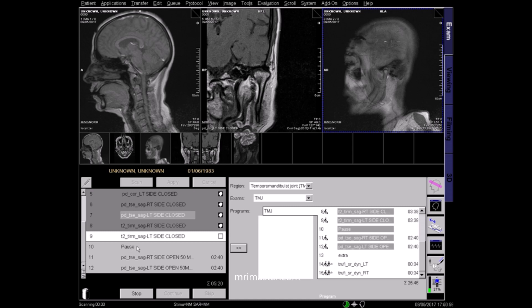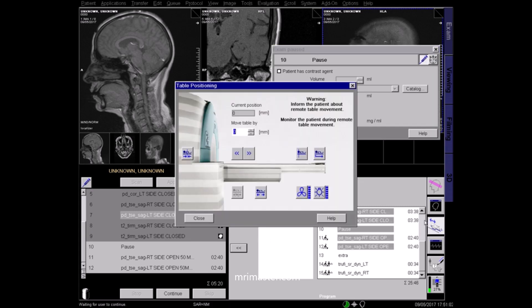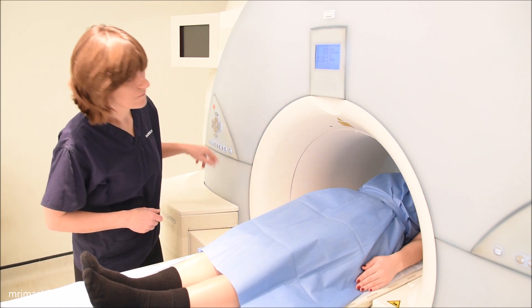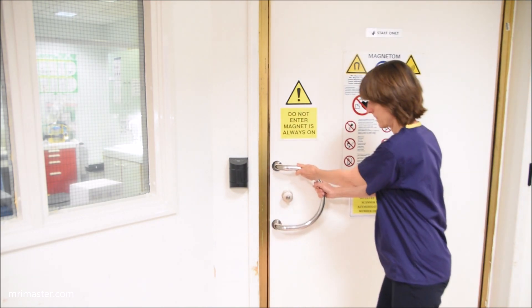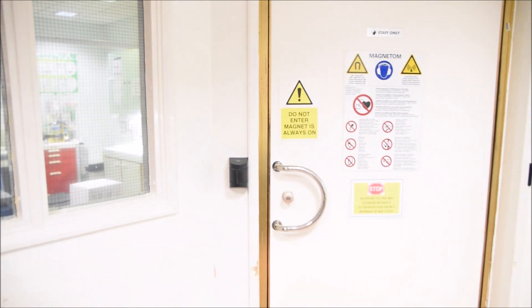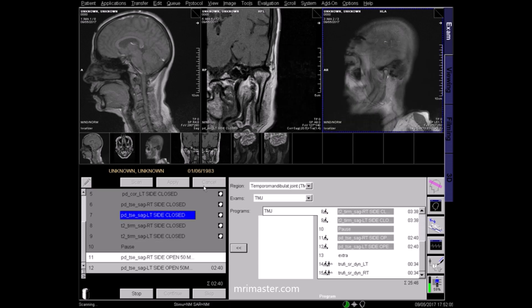Once all the closed mouth imaging has been acquired and reviewed for image quality, move the patient out from the bore of the magnet, instructing them to keep very still. Ask them to open their mouth and bite down on a syringe or bite block. In our department, a 50ml syringe is used. If the patient is unable to open their mouth wide enough to hold a 50ml syringe, then syringes of decreasing sizes should be tried. The mouth should be held open as wide as is comfortably possible. Once back in the control room, be sure to label the sequence with the size of the syringe you've used, or place a note in the patient record for the radiologist. Continue with the scan now.